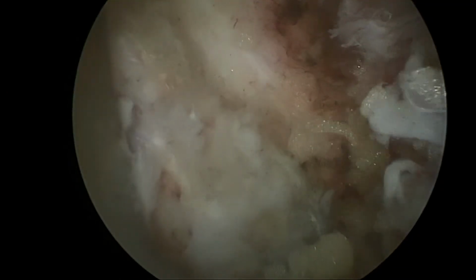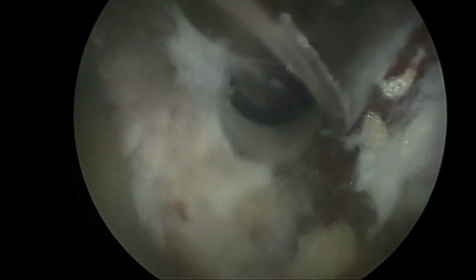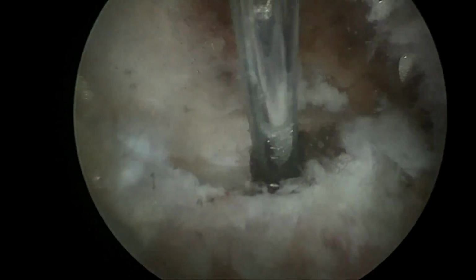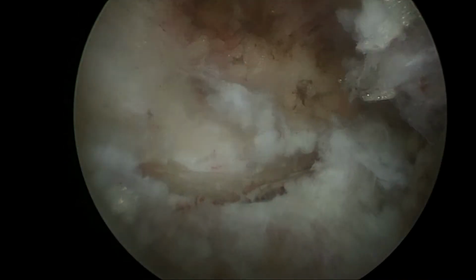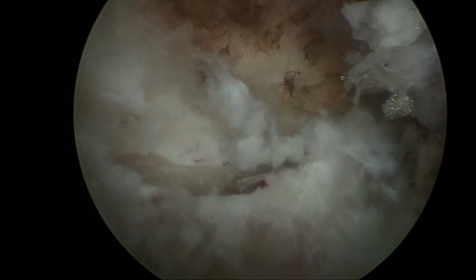The yellow ligament is then freed in its superficial attachments, and once adequately exposed, the drill is introduced in order to thin out its medial edge. Every level is different, and in this area I needed to remove a very small amount of the descending facet process.